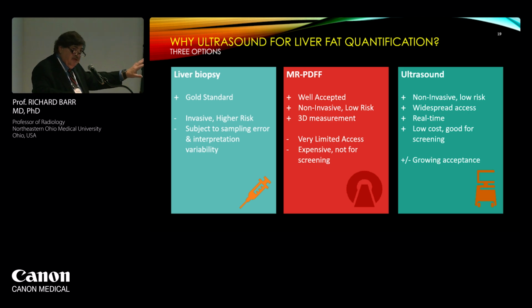MR-PDFF measures something completely different than liver biopsy, but it's been well accepted that we can come up with values, and I think it's now the gold standard, but again, not widely available and not cheap, and I doubt that MR insurance companies are going to let us do multiple MRs a year.